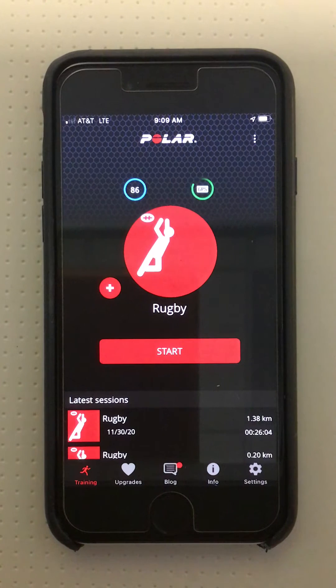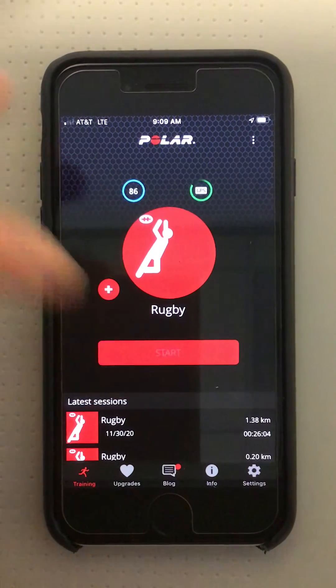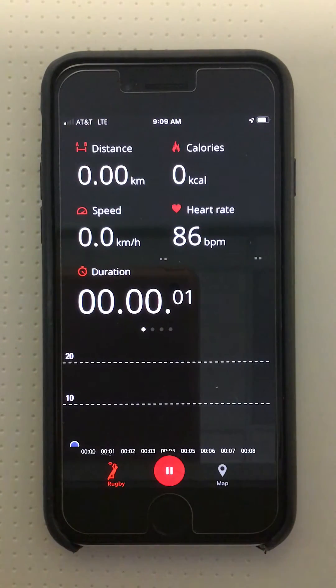Once the sensor is paired and the heart rate max has been entered, you're now ready to conduct a session. You're going to hit Start, training started, and recording will begin.